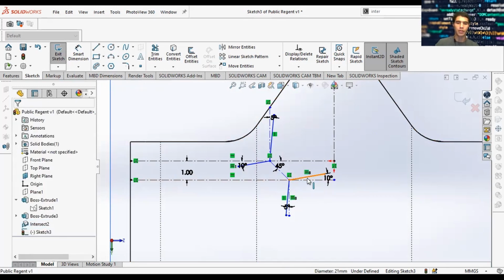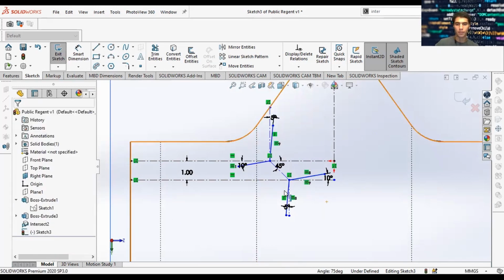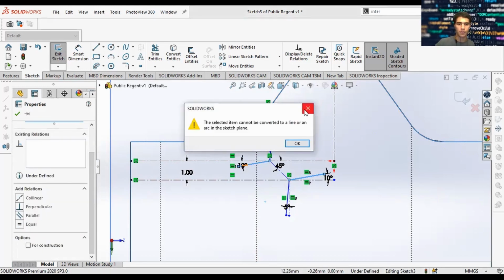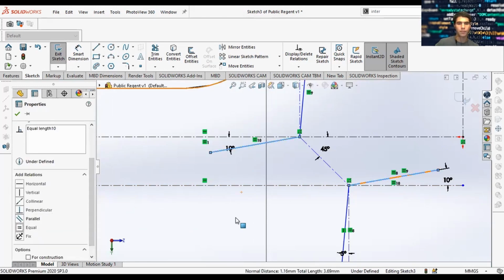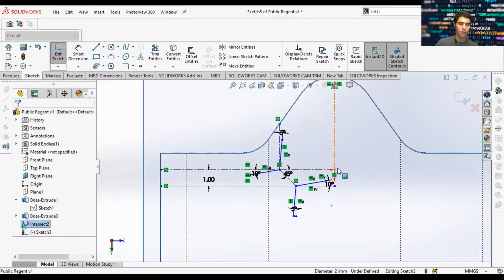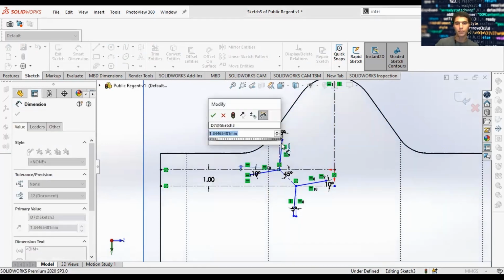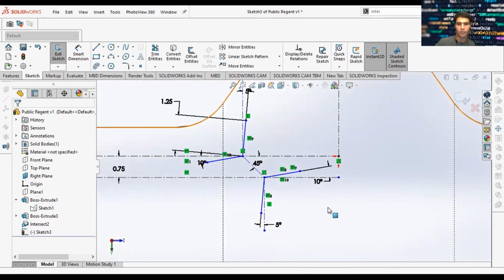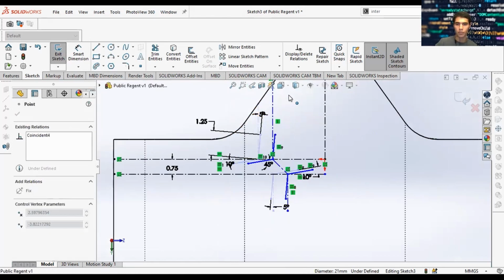So now we're adding parameters and relationships to further constrain the model. So these lines are now their different sizes, and we want to set them equal to each other. So this is what we'll be doing now. Going through each one, setting equal to each other. So they're the same length. So now we have the equal relationship. Now let's add an actual dimension. And we'll move this.